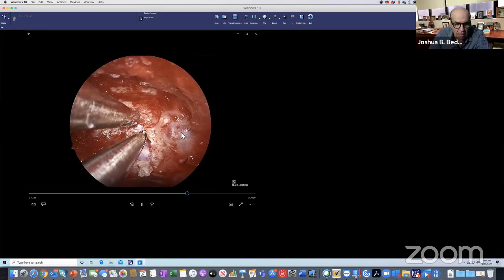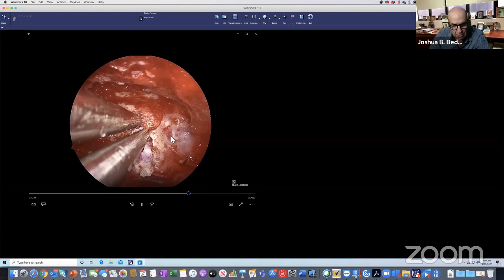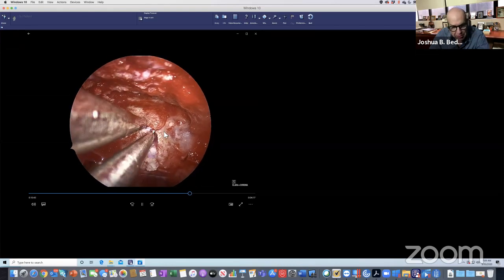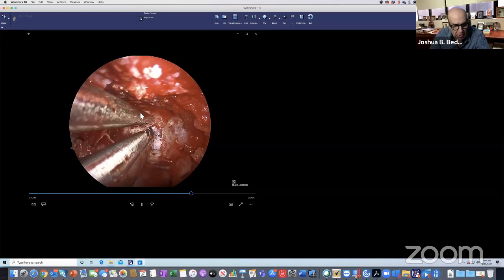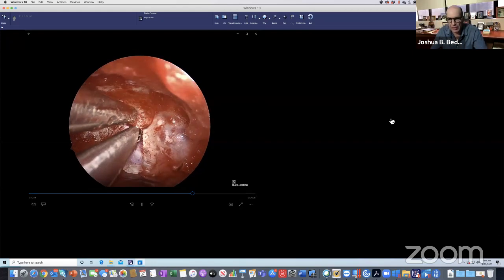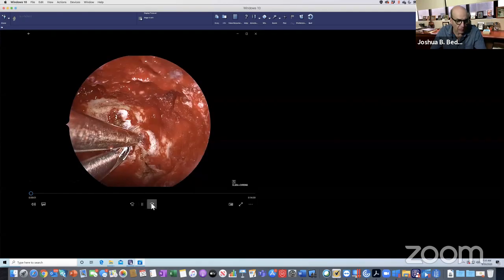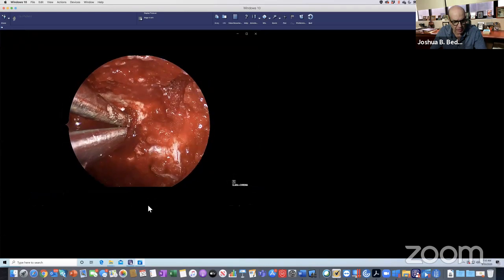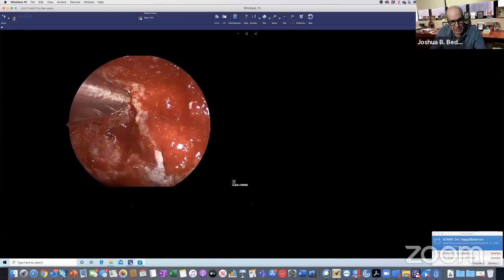So now, how are we going to safely remove this bone? Well, you're seeing the answer right here. I think it is far safer to do it this way, one bite at a time, because you can watch this instrument going in, and eventually you can get to a complete exposure of this here. Most of this case is exposure in my view. The whole thing is easy after the exposure.